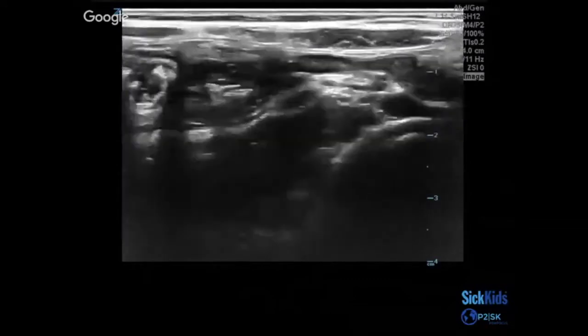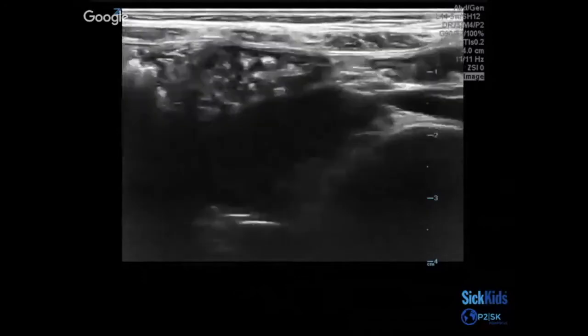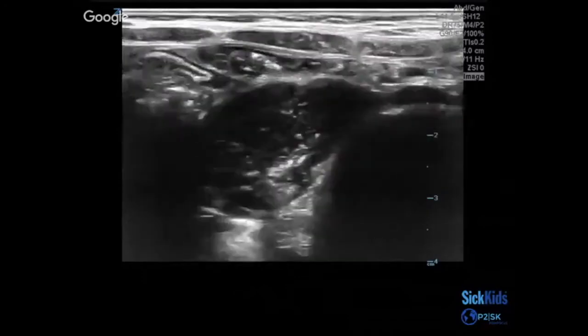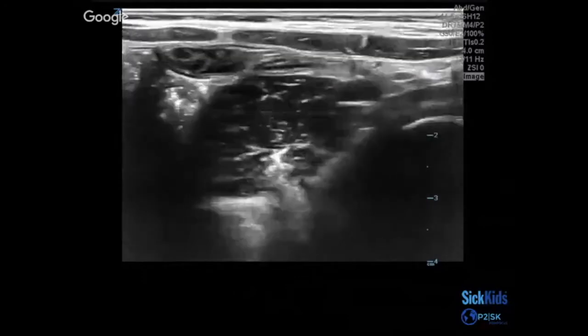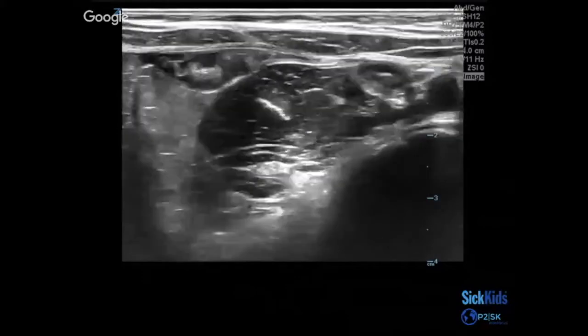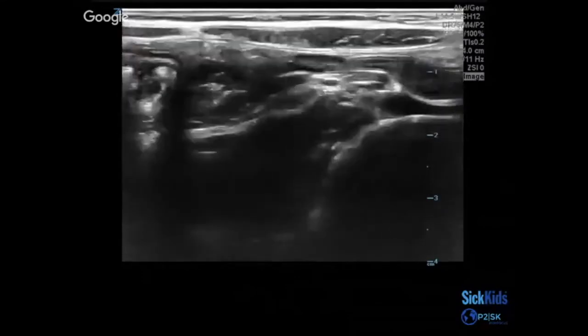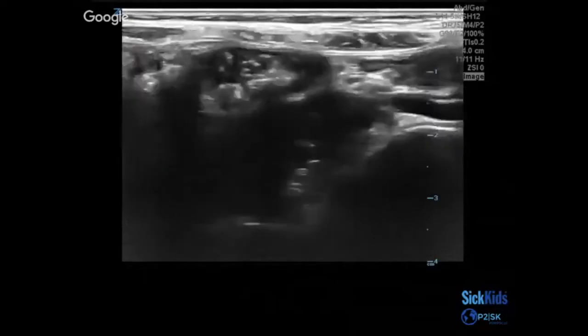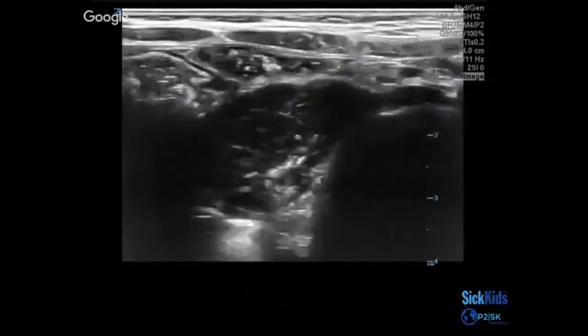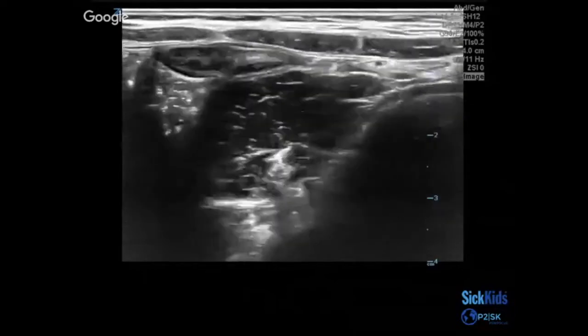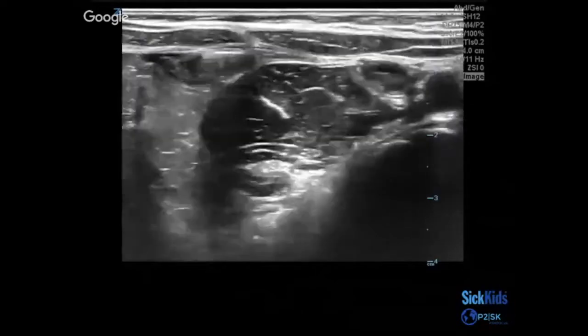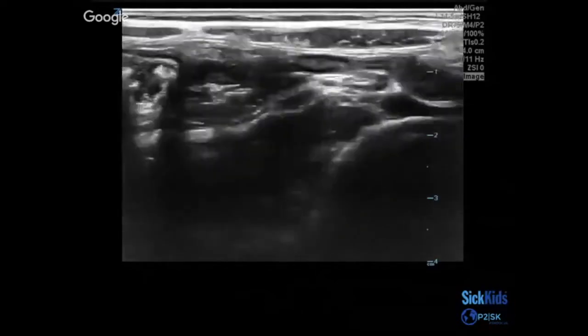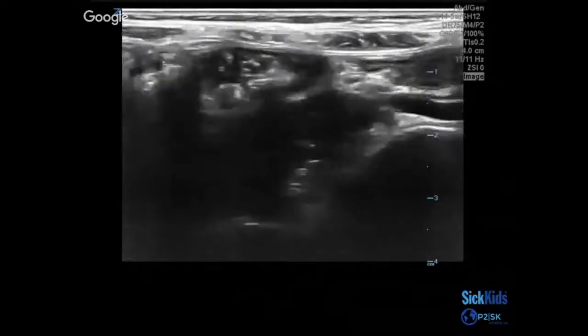You can see here at the beginning of the clip it's less clear, and then as you apply a little more pressure, you can see the psoas coming into view on the left of the screen and your vessels on the right of the screen.